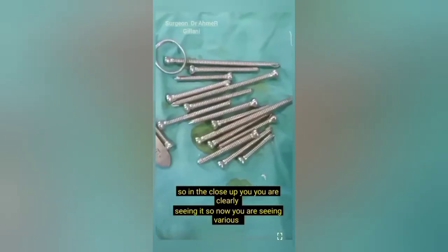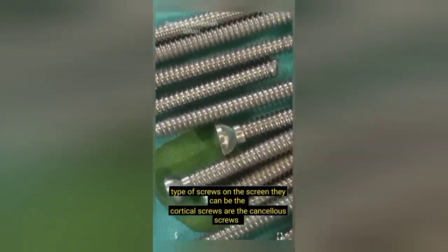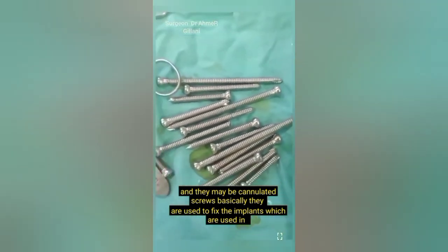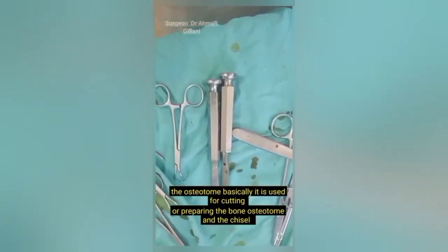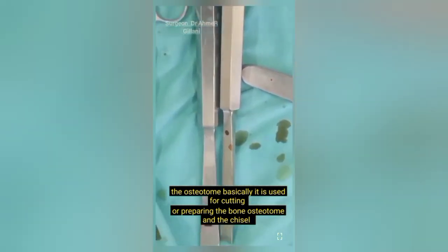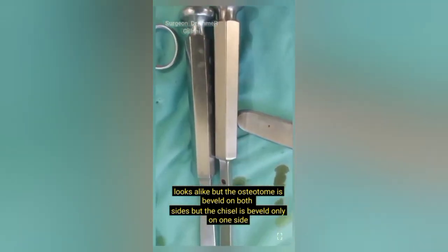This is the tissue protector, used to protect tissues during various orthopedic surgeries. You are seeing various types of screws on the screen — cortical screws, cancellous screws, and cannulated screws — basically used to fix the implants such as plates used in orthopedics. The next instrument on screen is the osteotome, used for cutting or preparing bone. The osteotome and chisel look alike, but the osteotome is beveled on both sides while the chisel is beveled on only one side.